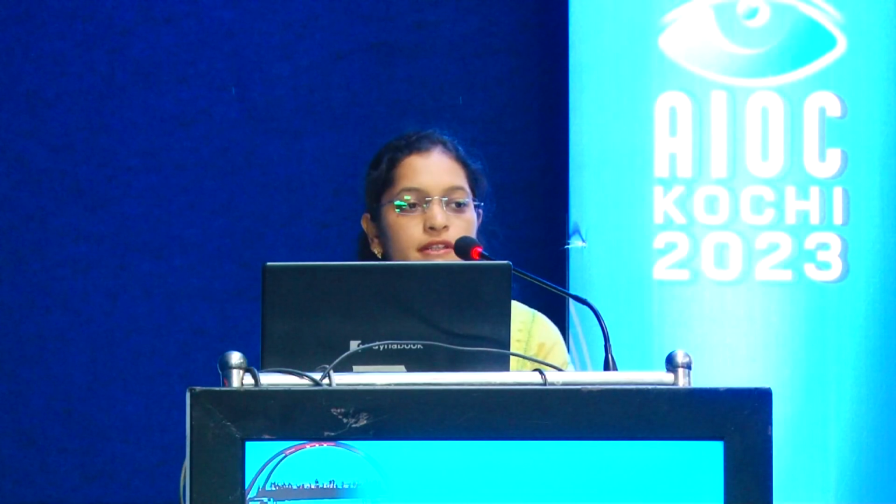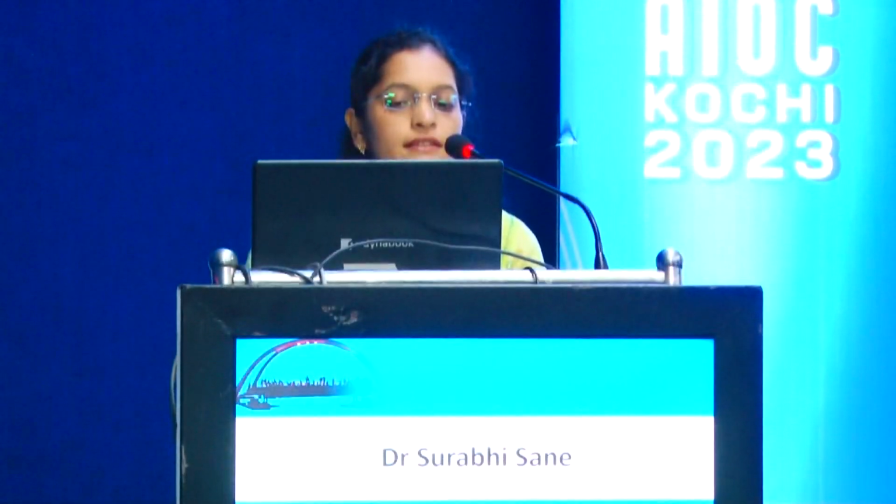Central serous chorioretinopathy, the characteristic features are serous retinal detachments, mainly involving the macula, and the other characteristic feature is pigment epithelium detachment. When the duration of the disease is more than 6 months, we term it as chronic CSC. In acute CSC, we get focal PEDs, whereas in chronic CSC, we commonly come across irregular or dimpled PEDs with a low height, and we can distinctly see the Bruch membrane underneath the PED. So these are termed as flat irregular PEDs.